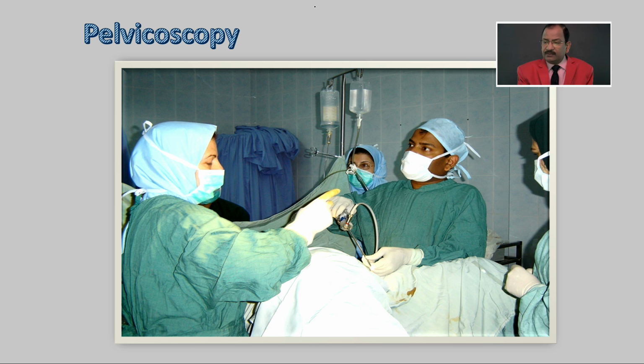Pelvicoscopy. Diagnostic laparoscopy plus hysteroscopy is called pelvicoscopy. Technically, this is the correct term. But many gynecologists write hystolap. That is okay, but the actual correct scientific term is pelvicoscopy.